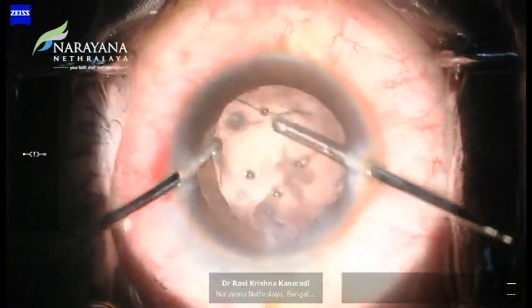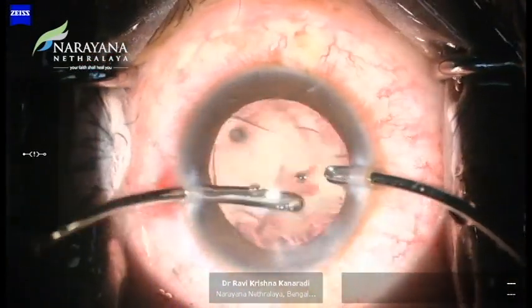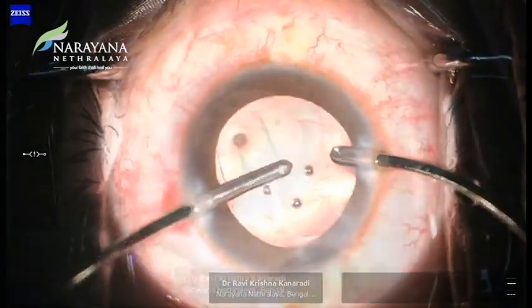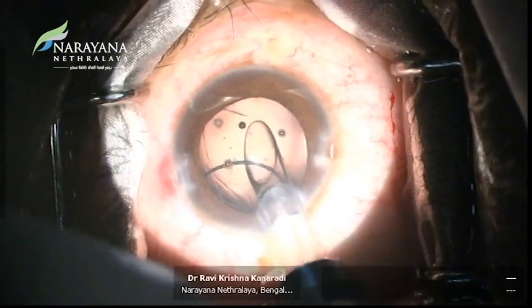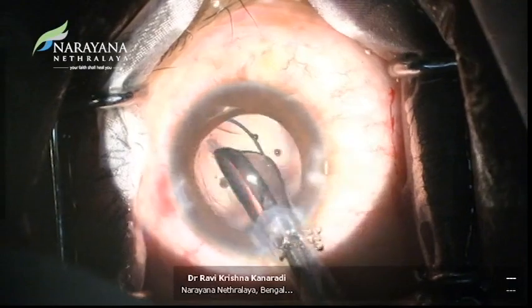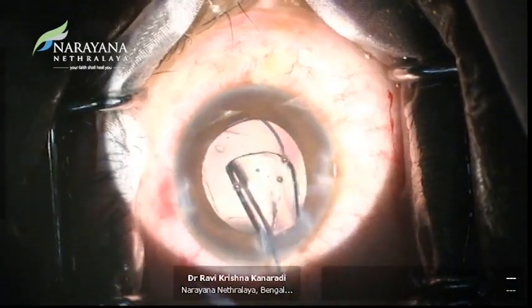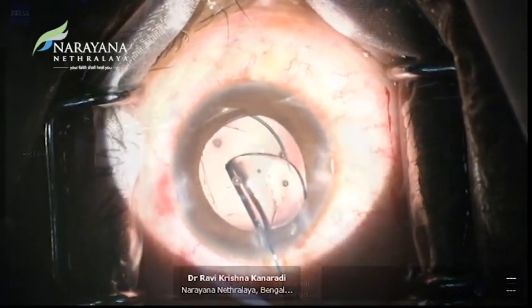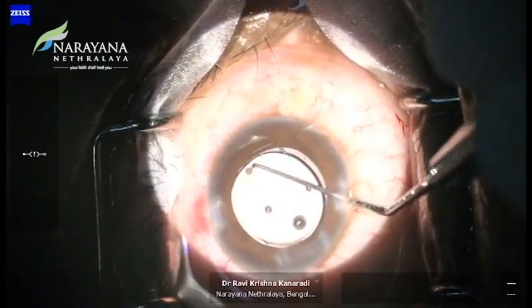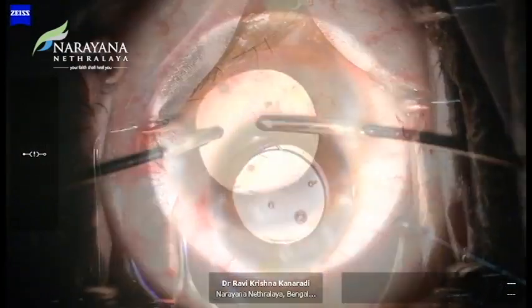At this point, we can also appreciate the extension of the anterior lens capsule at 10 o'clock and 7 o'clock. Hence, we decided to go ahead with 3-piece intraocular lens implantation in the bag and try orienting it perpendicular to the existing anterior capsular tear. Viscoelastic removal was done and the wounds were sealed with hydration.